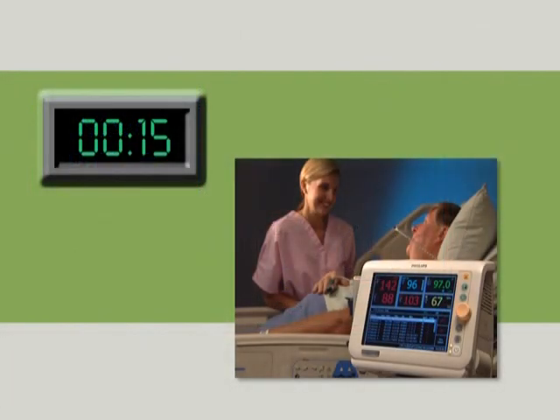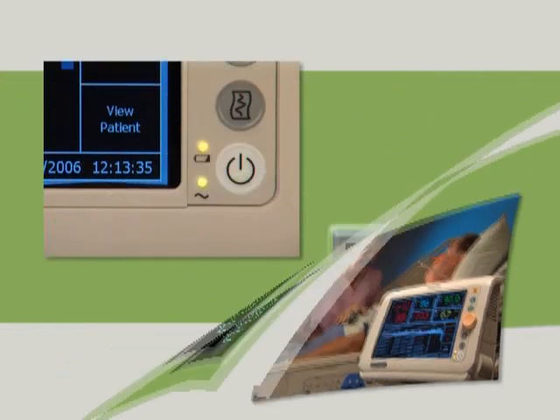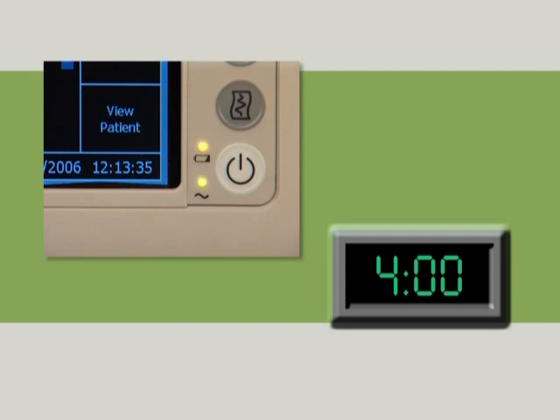During normal use, or around one measurement every 15 minutes, the battery should last about 4 hours. It is recommended that you keep the monitor plugged in to AC power whenever possible. It takes about 4 hours to fully recharge a battery that is completely discharged.